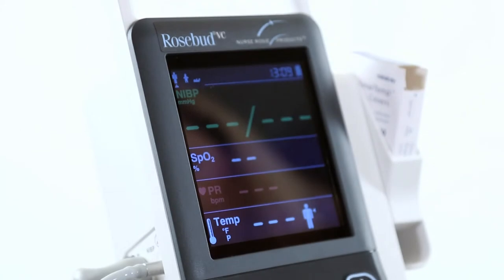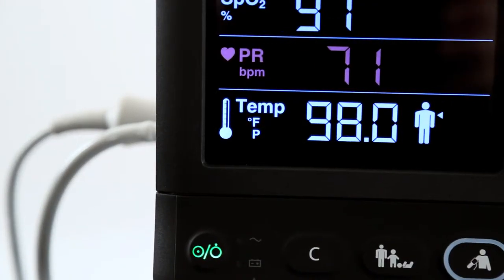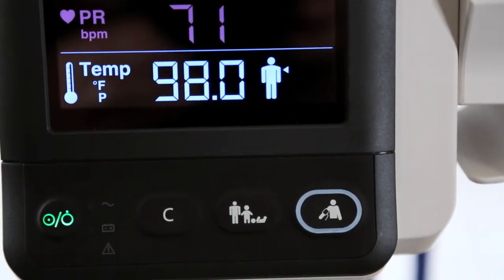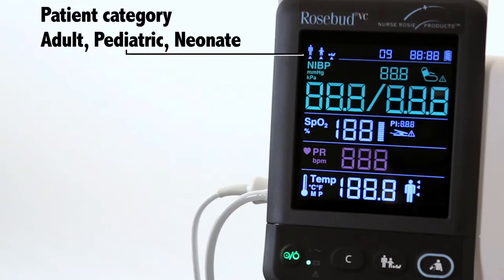Rosebud VC is easy to use with its high definition touch screen, easy to find control buttons, and simple to use directions. Rosebud VC will display the following patient categories: adult, pediatric, and neonate.